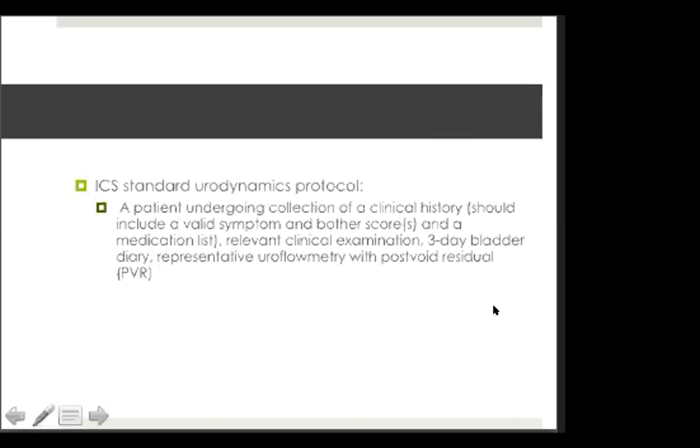Then, for example, small bladder capacity din niya, kung may small bladder capacity siya, kagad siya mag-void after mapuno na po yung bladder niya, sir. Okay, so basically, you will be able to get the bladder capacity of the patient. So from there, kunyari, magagawa ka na ng urodynamics, kasi nag-bladder diary ka na eh.